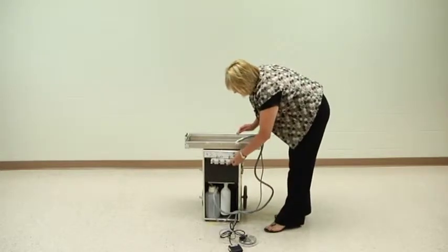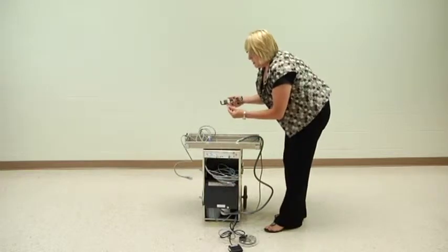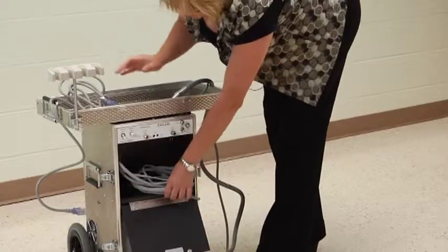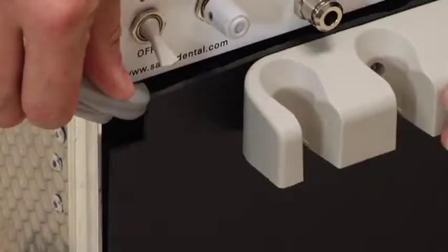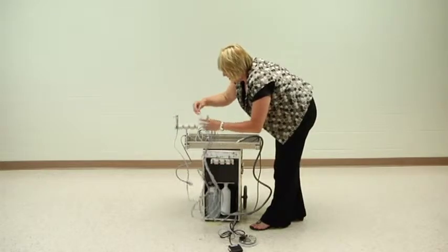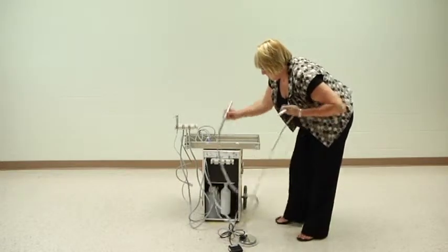On the top of the unit is housed your power cord. There's also another hose mount that you can use, along with your hand piece hoses and your air water syringe hoses. They can be placed on either the mount on the top or in the mount on the front of the unit.